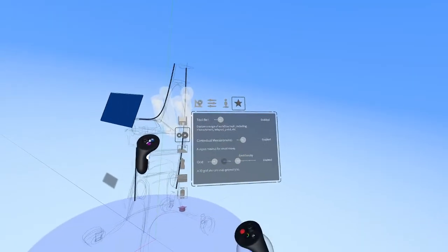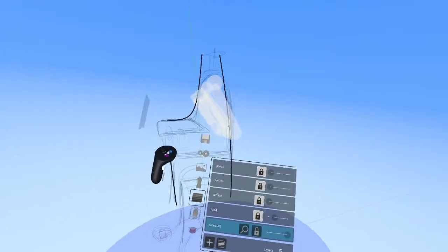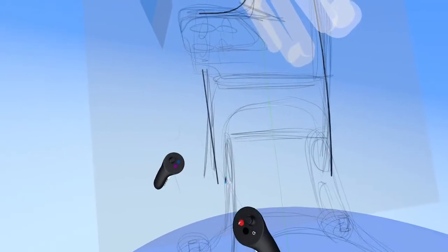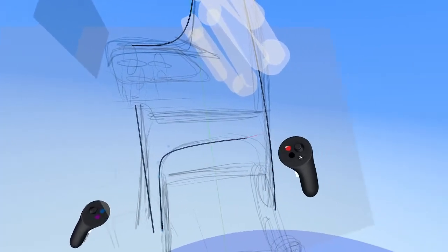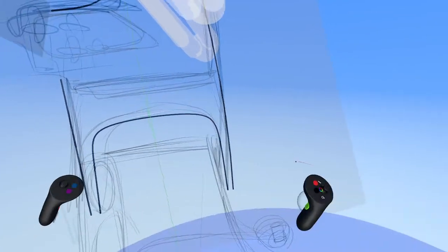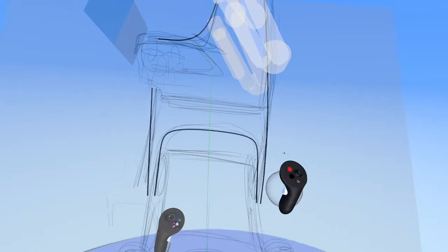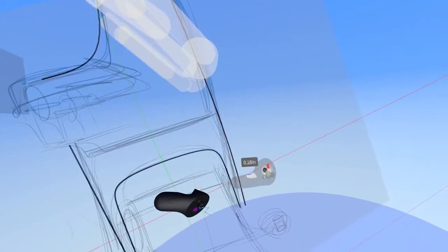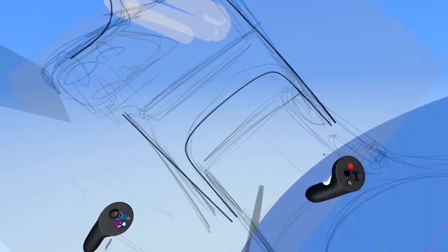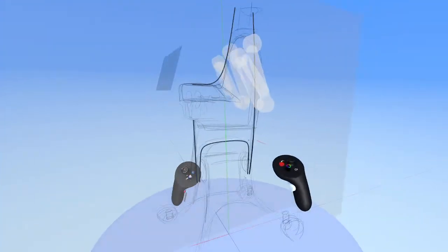All right, so now that we have that, let's just drop that on the robot layer as well. Ghost it out there. We could just use it as reference. And yeah, let's continue with the side view. So back to the stroke tool here. Let's get the inside shape. Close that off. Put it into edit mode and just tighten it up a little bit. Shift that out, or actually, let's shift this in a bit. All right, that looks decent.